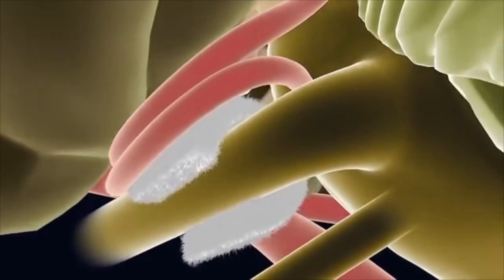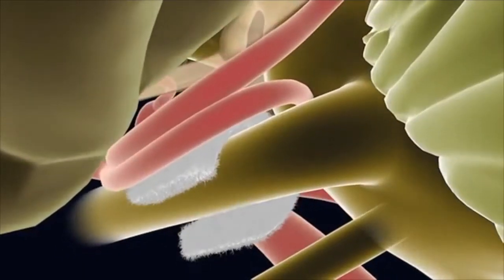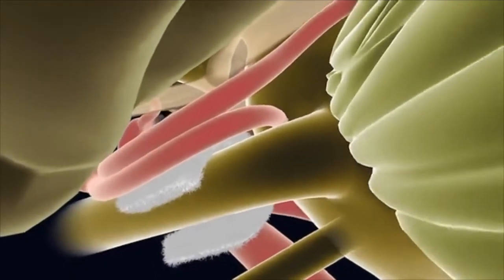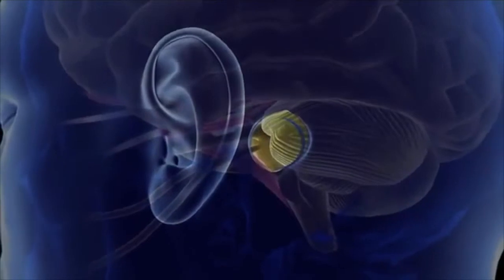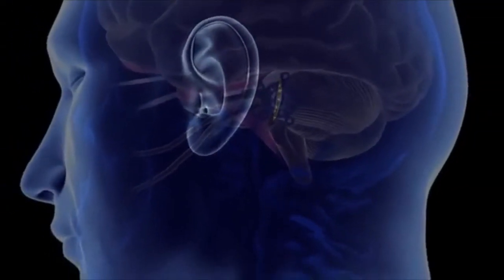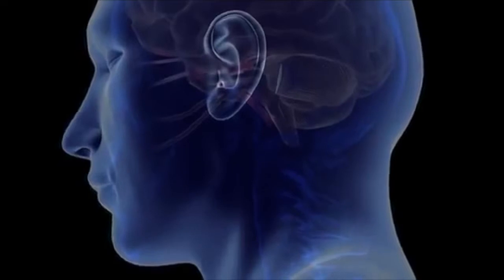By doing this, the abnormal compression of the nerve that is causing the pain is relieved. The endoscope is then removed, the bone opening repaired, and the scalp closed, showing only a small incision behind the ear.